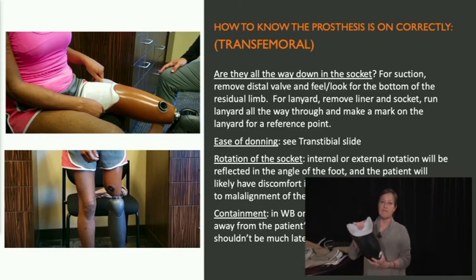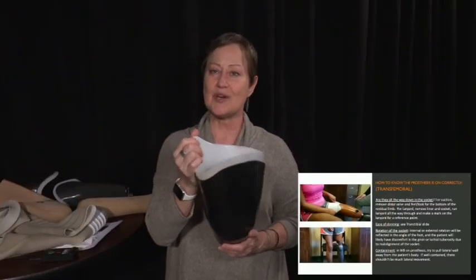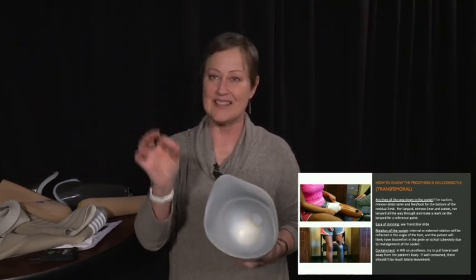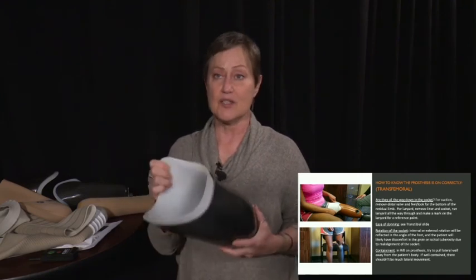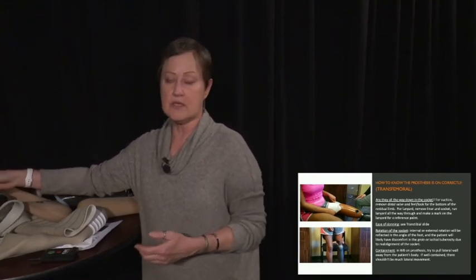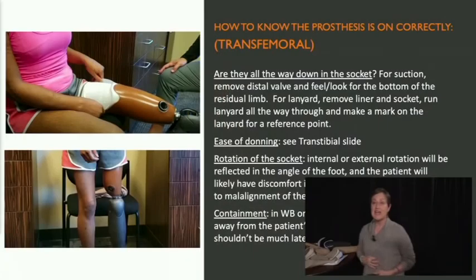For the transfem patient also, the sockets are made so intimately that if it's rotated the tiniest little bit, if it's an ischial containment socket, the patient will know. It's going to poke them in a place they don't want to be poked, and that's typically rotation. Now, if they don't have enough socks on, they're walking, could the socket rotate a little bit in the course of walking, and then they say it's poking them, and that kind of gives you a clue that they need to snug up that fit a little bit to maintain the right placement of the socket on their leg.